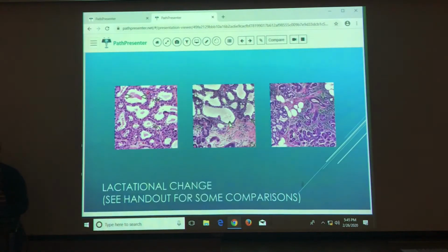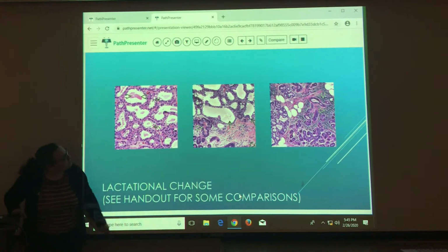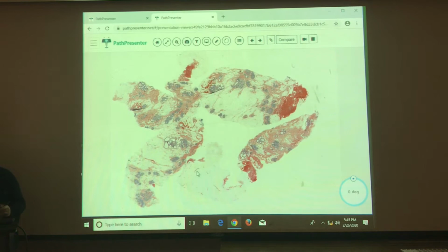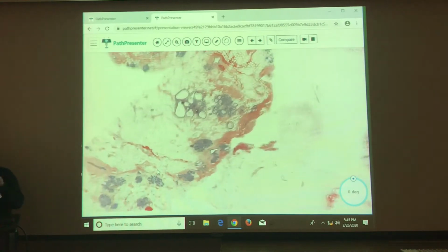You good? Okay, so no fancy outlines, just a little bit of pictures. So you can kind of be looking for more of the eosinophilic stuff. But generally they're just kind of crazy looking and very scary. Okay. It's a busy slide. It is a busy slide, yes.